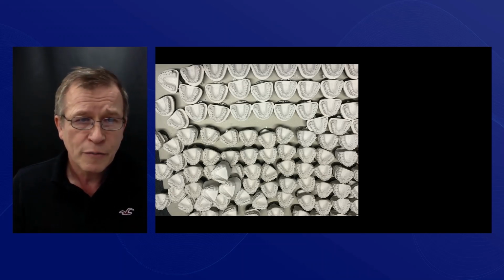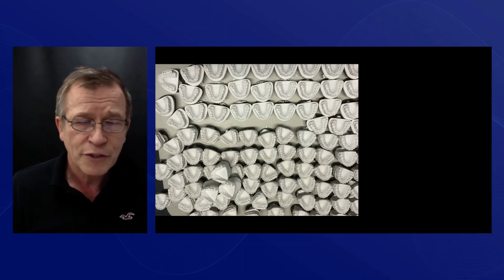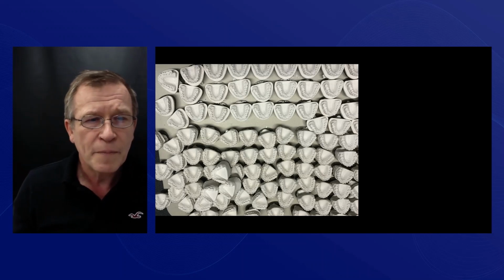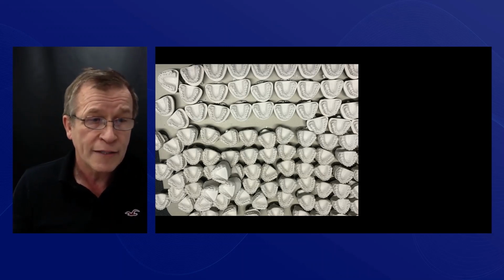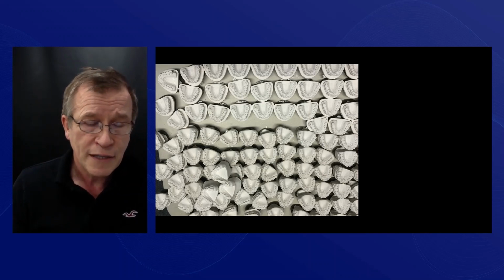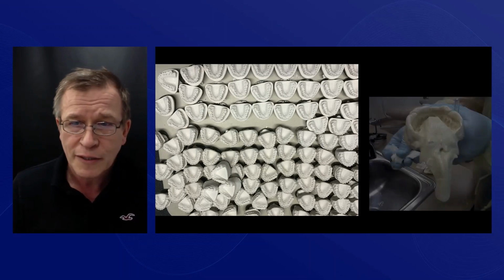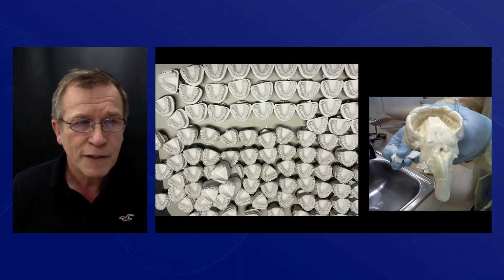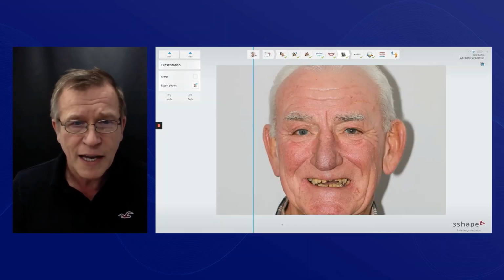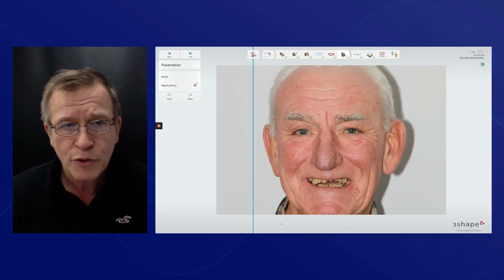And now, within a few seconds of scanning the patient, we can be looking at those things together, and we have it there as a great record that we've checked to make sure that it's accurate before we start to proceed. Now, there are some things that scanners can't do, and we'll be very grateful that we can't do this. I've never had a scan that far down a patient's mouth. But most of the time, I think they provide us with more and more solutions.